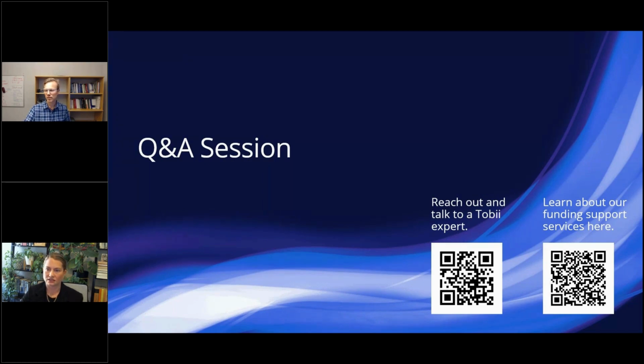Okay. Let's see. Do you need the eye openness data to use the algorithm? For our particular systems, yes, for the Spectrum and the Fusion. Our other eye trackers won't measure eye openness at this point. So if you want the eye openness data in this particular algorithm, you do have to have either the Spectrum or the Fusion. Go ahead, Marcus. I can add also that on the GitHub page, there is example data from both the Spectrum and the Fusion that you can play around with. So you don't need your own eye tracker to actually play around and test the algorithm. Great.